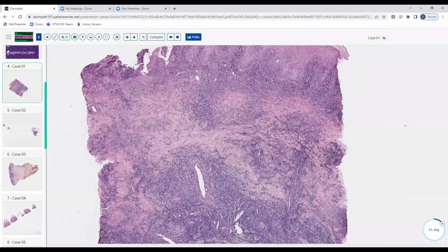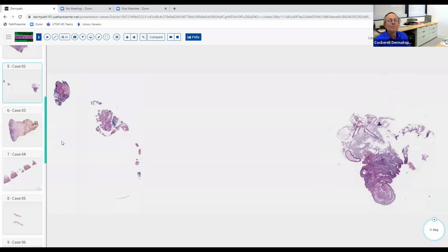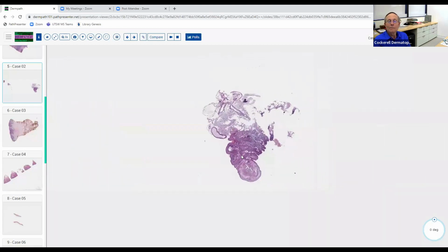Thank you. You're welcome. This guy gets an A+ for the type of biopsy that they did, by the way. Okay, there's something different here.